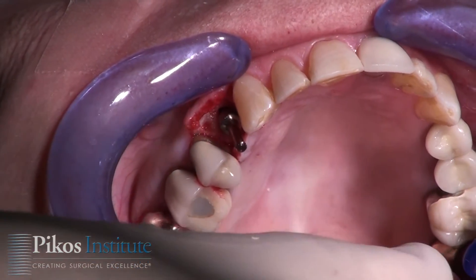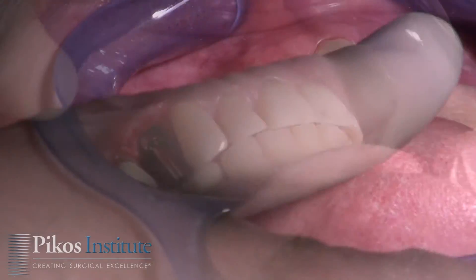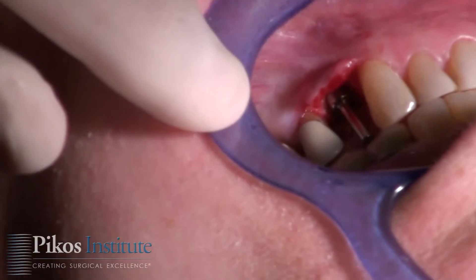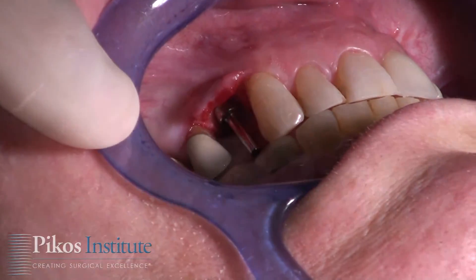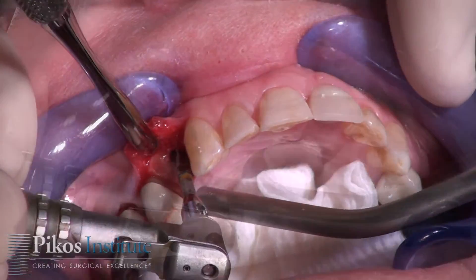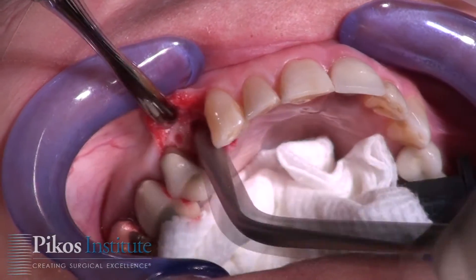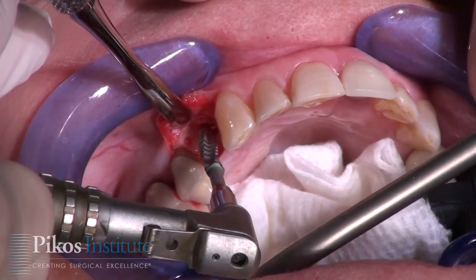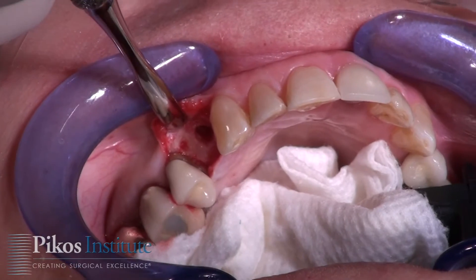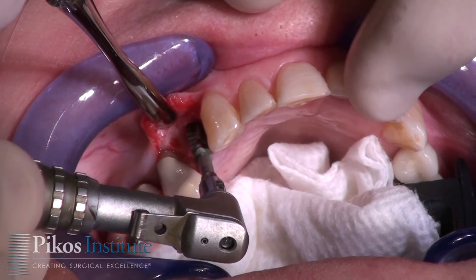Now slowly — if you could close down, bite down all the way on your back teeth, keep biting — verifying that the directional pin is going into the central fossa of the adjacent bicuspid, so we're in good shape. We'll continue with the 3.2 diameter burr, and now with our next burr which is a 3.7 diameter, and the final burr which is a 4.1 millimeter diameter.